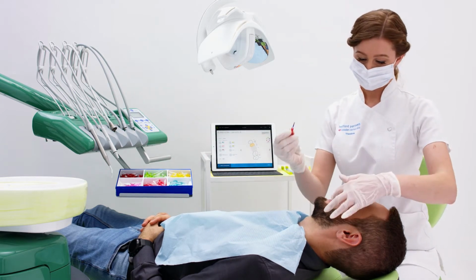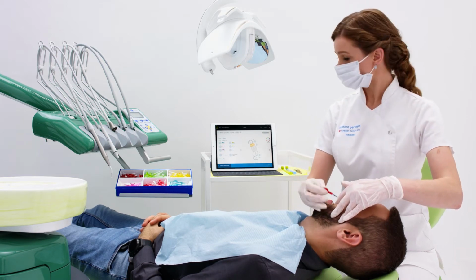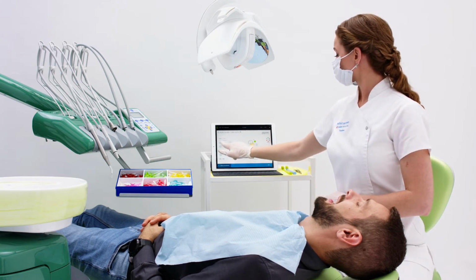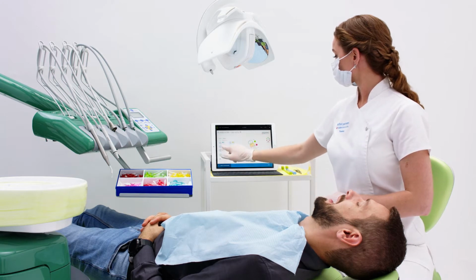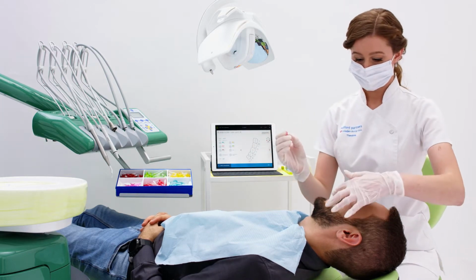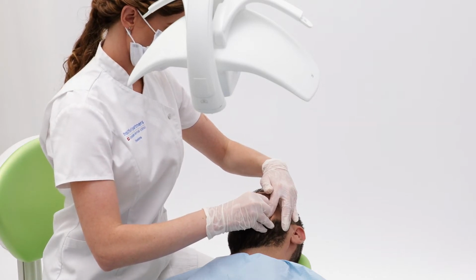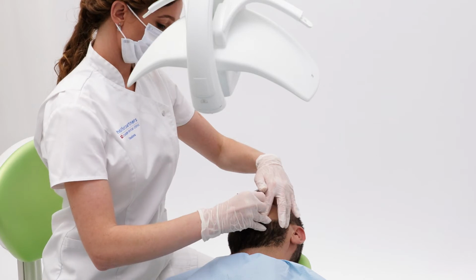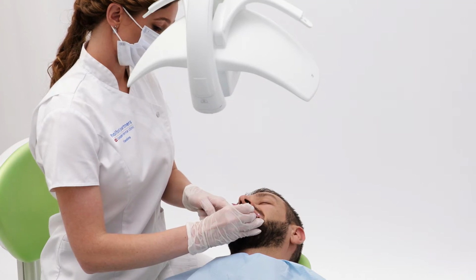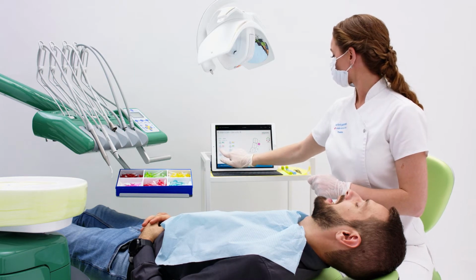As I continue to the upper left sextant, I notice that an interdental space is too large for the colours indicated on this IAP. So I change to the perio IAP to measure the interdental space. I then return back to Bob and input the correct colours from this sextant.